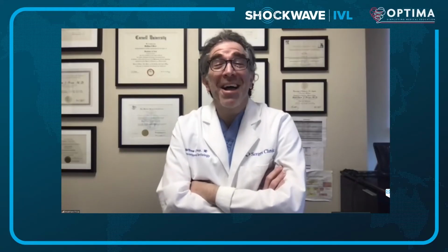Yeah, I mean, I'm an imaging enthusiast, but I've done plenty of cases, both rotation and IVL, without imaging. So how do you do that? It's a practical approach. First, use fluoroscopy. You can see the calcification. Test it with a balloon. Does it crack? If it doesn't, and you have a decent lumen, go to IVL. If you can barely get a balloon across, choose rotational atherectomy.